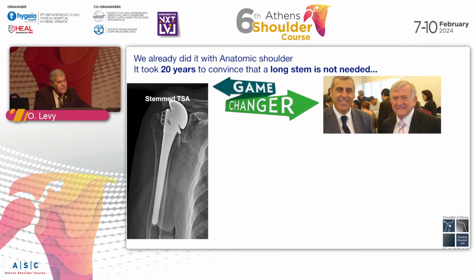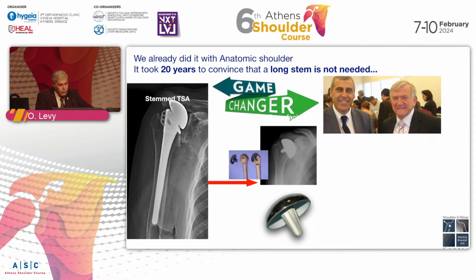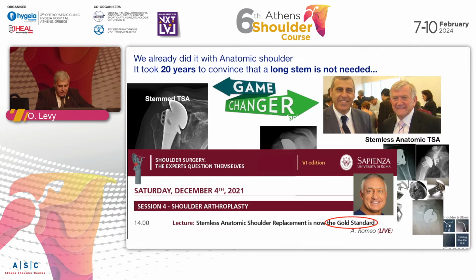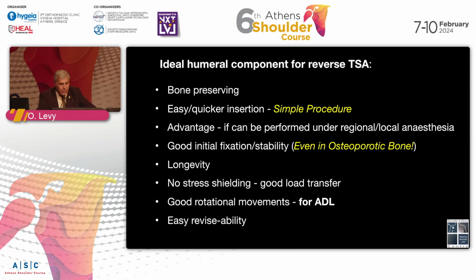We already did it once with the anatomic shoulder. It took Steve Copeland, my mentor, friend and teacher, who was a game changer with resurfacing. It took us about 20 years to persuade the world that a long stem is not necessary for an anatomic shoulder. And we went from the stem through the Copeland resurfacing to the stemless anatomic that is now used everywhere. And actually, I was pleased to hear Tony Romeo two years ago in the Rome course saying that stemless anatomic shoulder replacement is now the gold standard. I hope that the day is not far when the stemless reverse will be the gold standard.